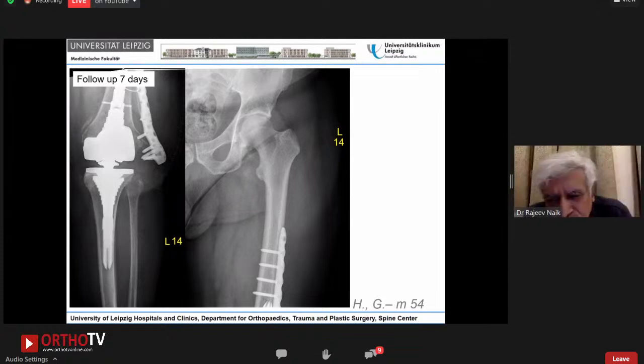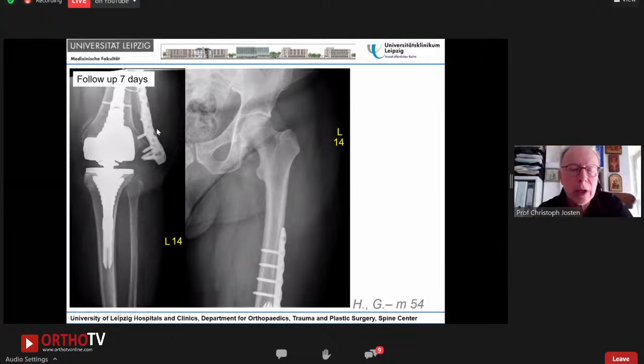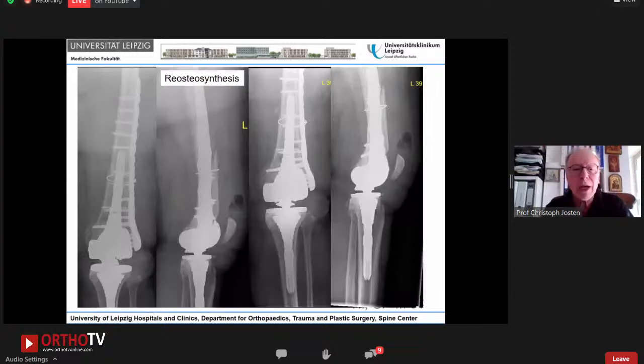This you have to rule out infection. Yes. So this is a loosening of the plate. So we went ahead and made a re-osteosynthesis. We removed the plate. We made another angle stable plate. We used a lot of screws. We also made a wire cerclage here.